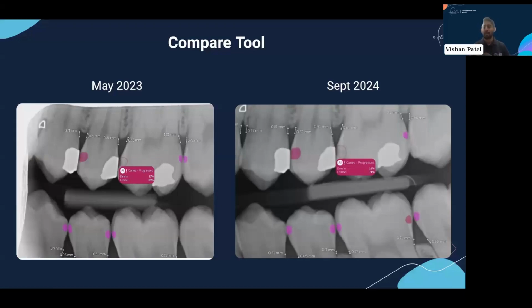I've also had patients come back and say, has it got worse or has it got better? I'm doing it as a hygienist before I varnish, so they get a little more involved in looking at their x-rays rather than just leaving you to it and seeing what you've got to say. Do any of your patients ask for the printouts themselves? No, I haven't had anyone ask for the printout. I just send a printout.